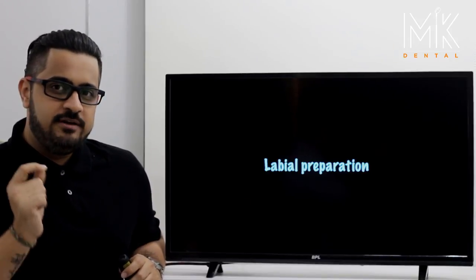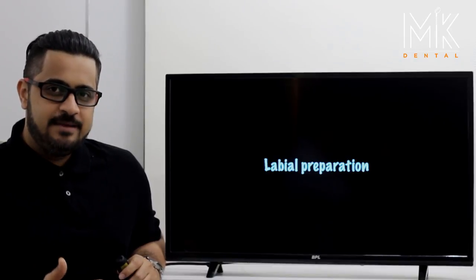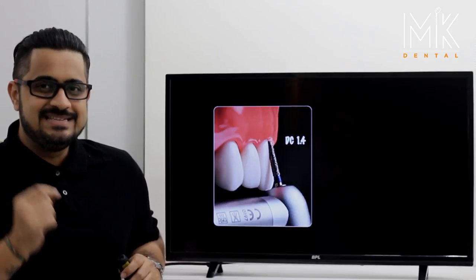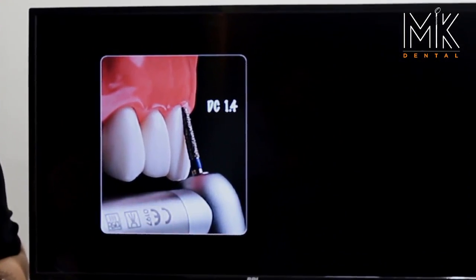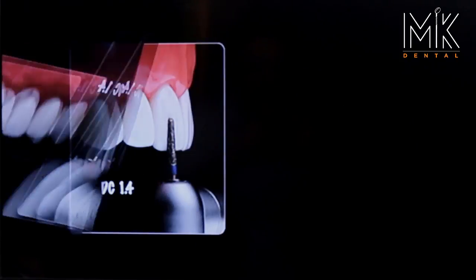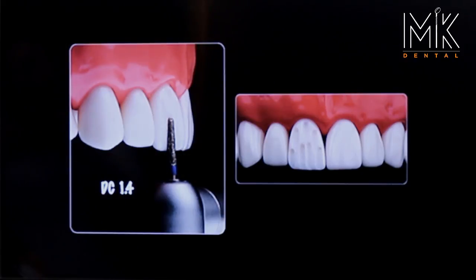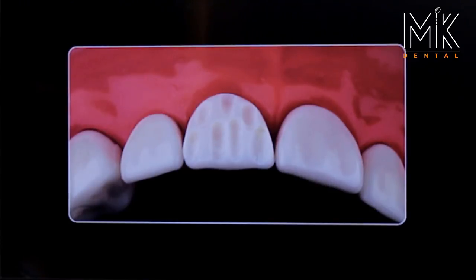This is the DC 1.4 burr. Because it's a deep chamfer burr, we will sink in only half depth first. The burr is placed towards the cervical plane — this is what we call plane one of the preparation. Sink the burr half depth over two or three areas, giving you depth orientation in plane one. You now straighten the burr towards plane two and sink it half depth again, making multiple grooves. You can clearly see in this image that you have plane one and plane two grooves appearing at two different junctions.